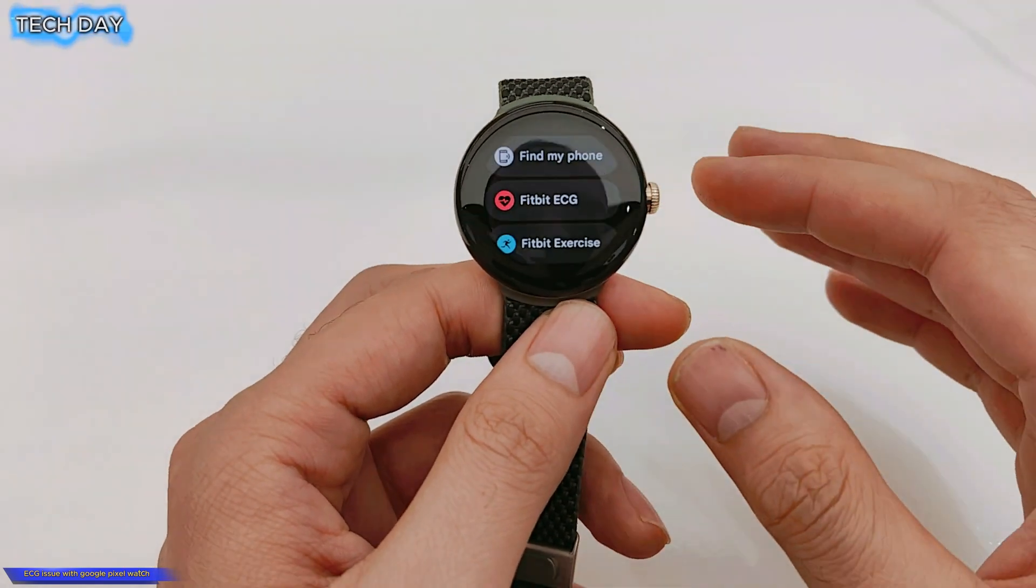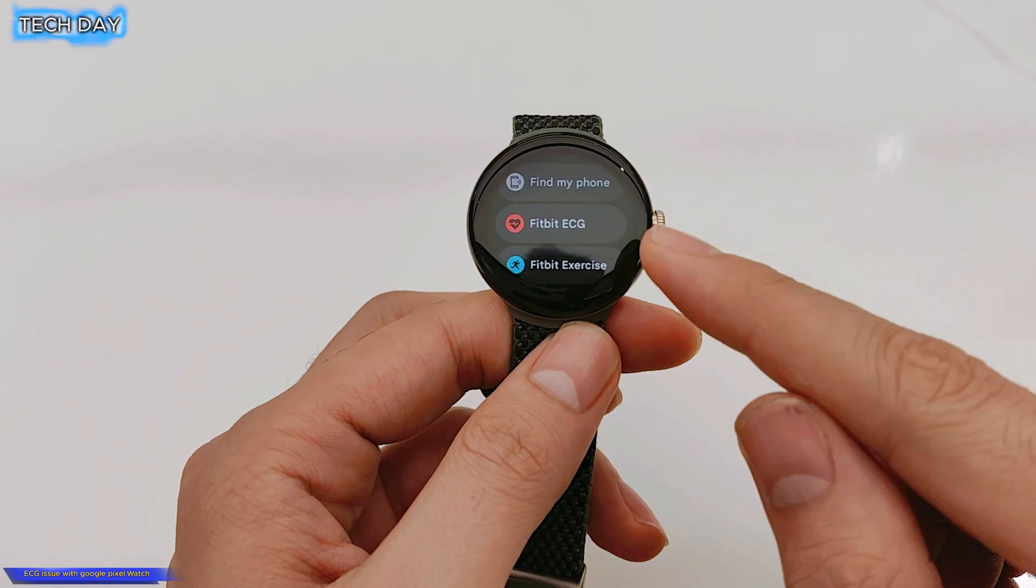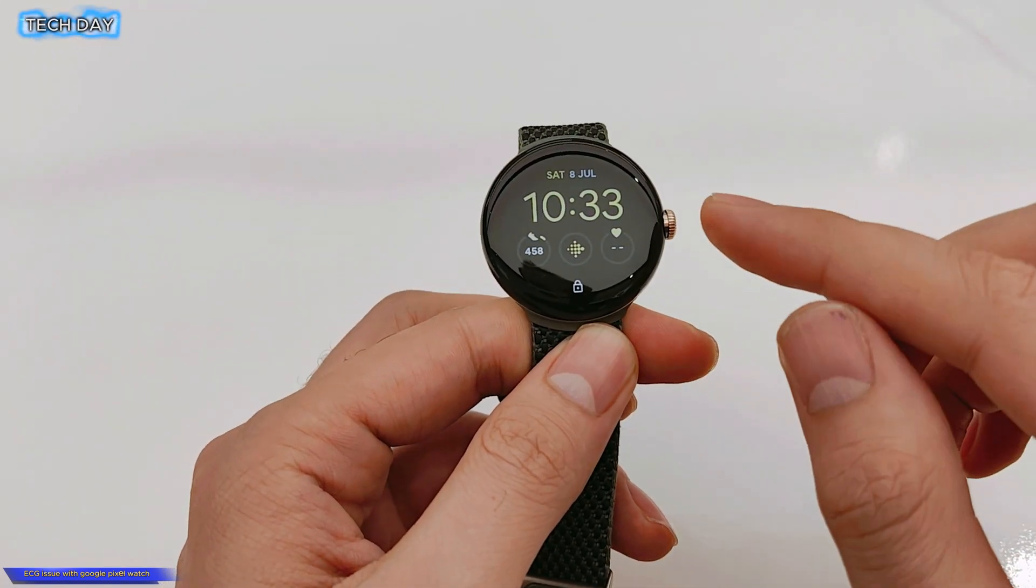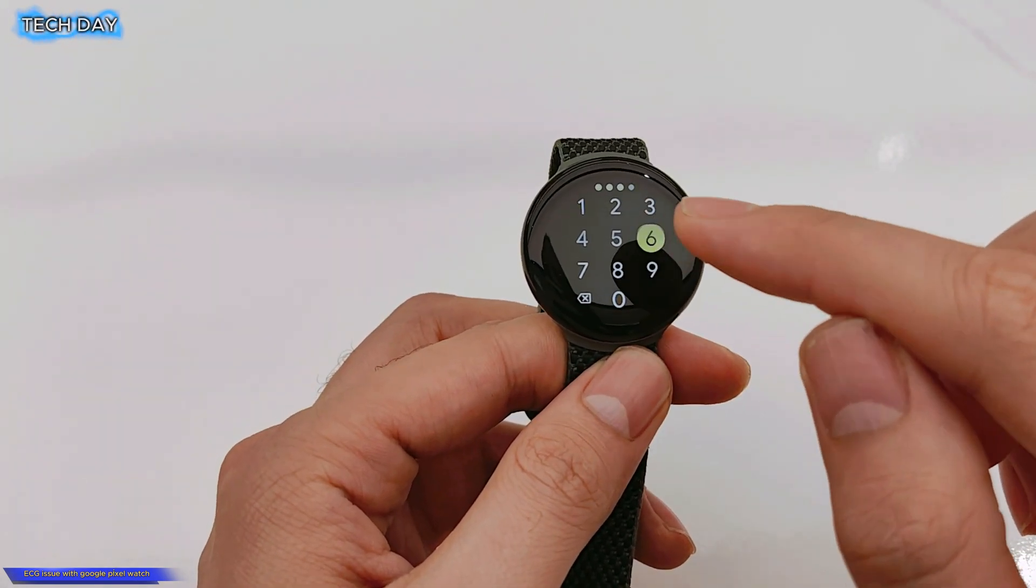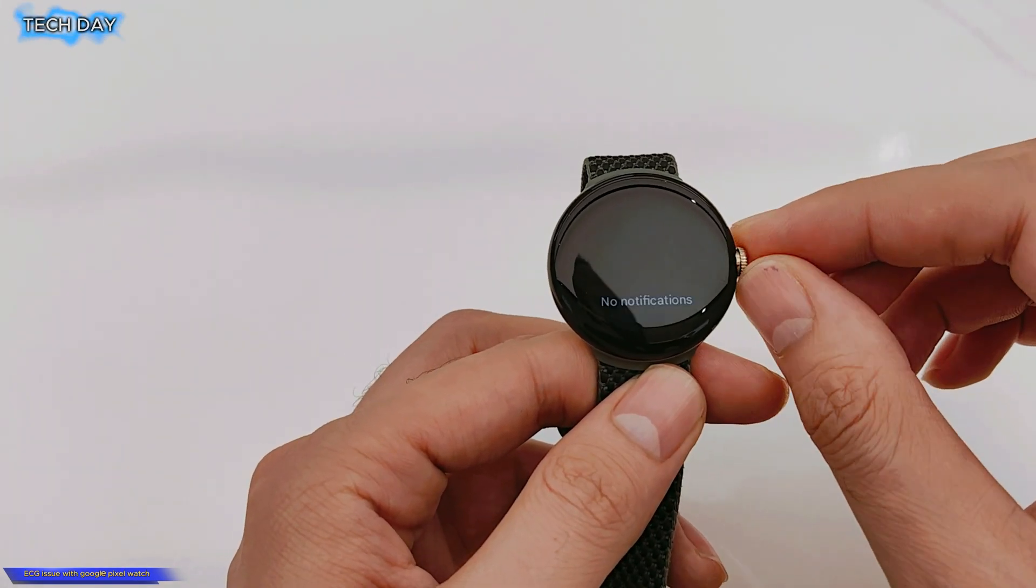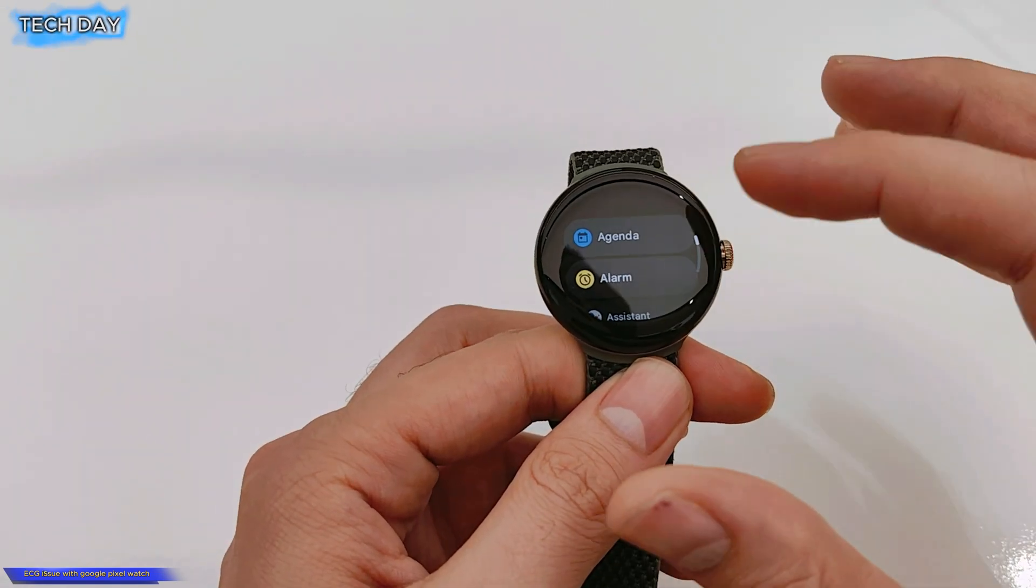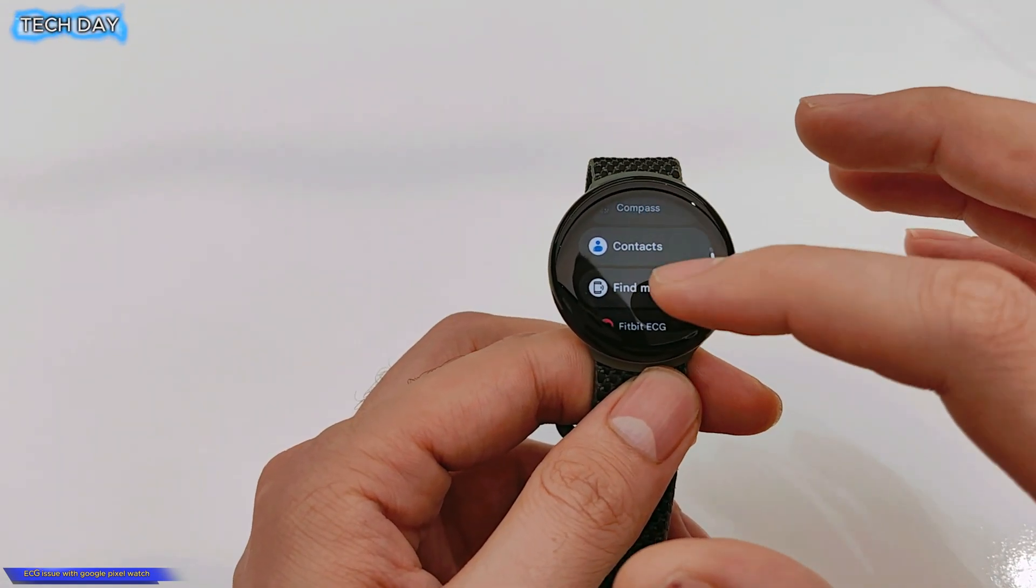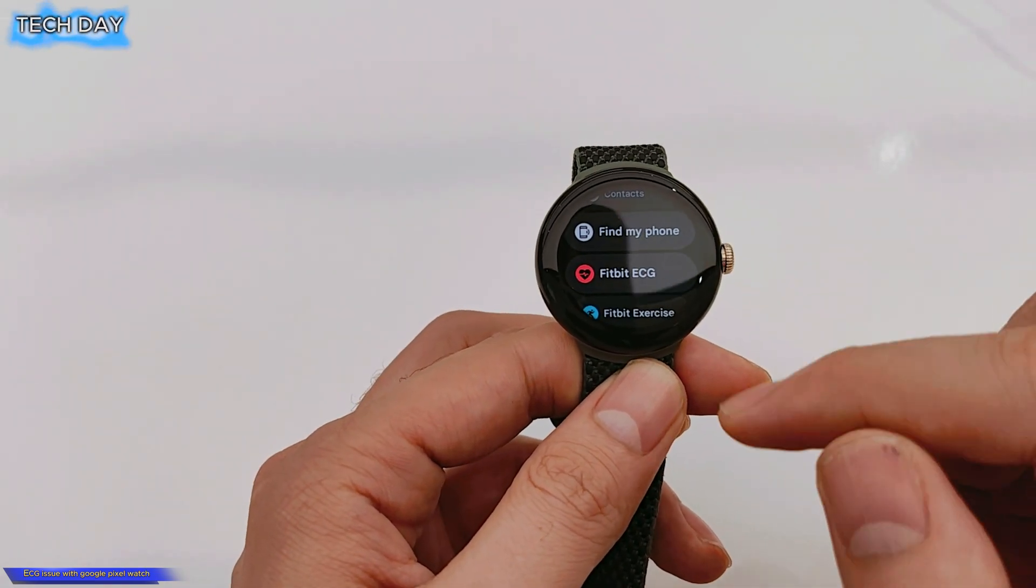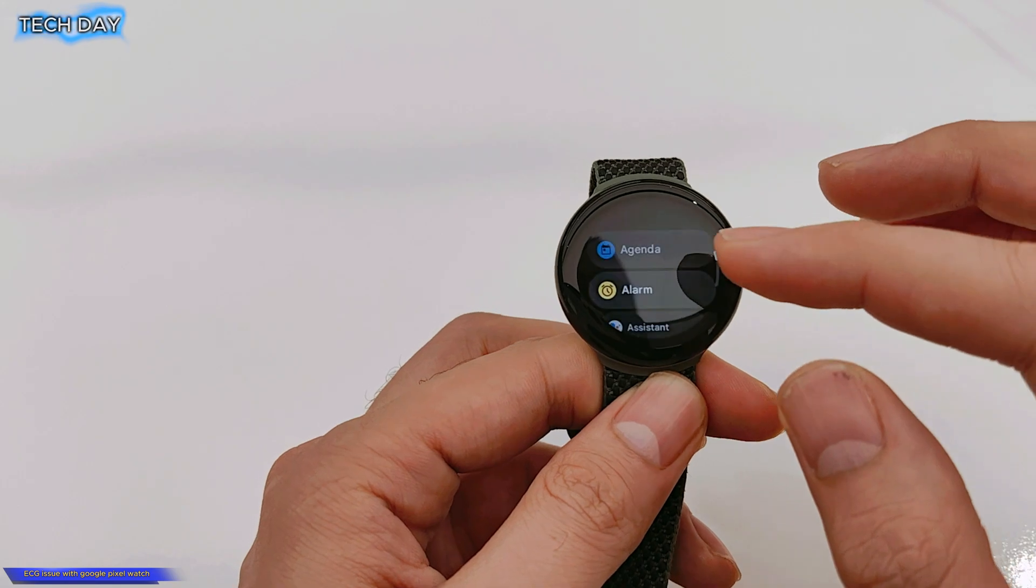Hello guys, today's video I will be sharing with you the solution or the way how to get the Fitbit ECG on your Pixel watch if you face this issue. Once you reset your watch or make the factory reset and you figure out that the ECG is not there, or Fitbit ECG, even if you search it in Google Play you will not find it.